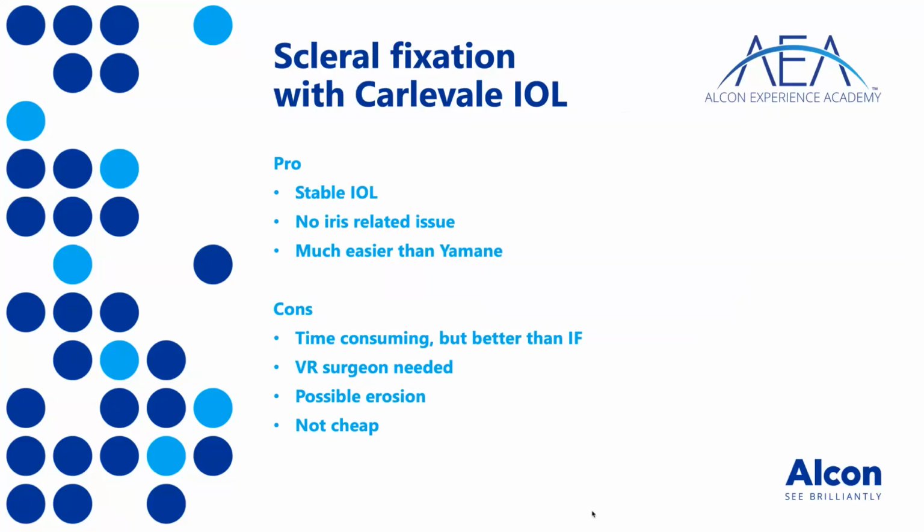You need a little bit of a learning curve at the beginning to know exactly how to handle the instruments and the insertion of the lens, because as I said, it's beautiful, it's very smooth, it goes inside the eye in a second, which is very good and very bad at the same time, because if you go too quickly, this is going to open up immediately, and then you lose it and it falls in the back of the eye, and then you run into trouble to recover it. So there must be some sort of balance that you have to learn.